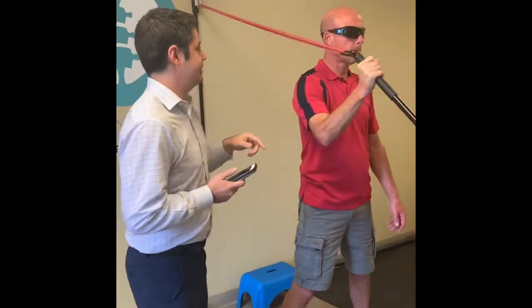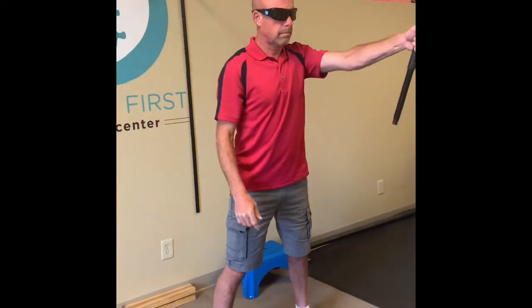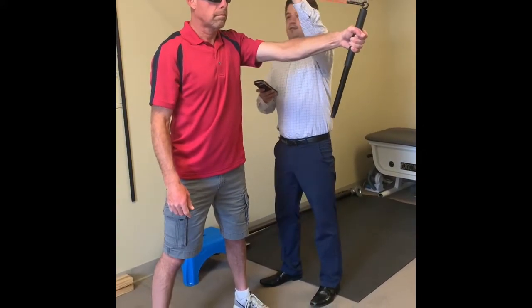Let's go ahead and switch arms again. I'm going to change the setting on the glasses — we're going to go to my favorite setting here.